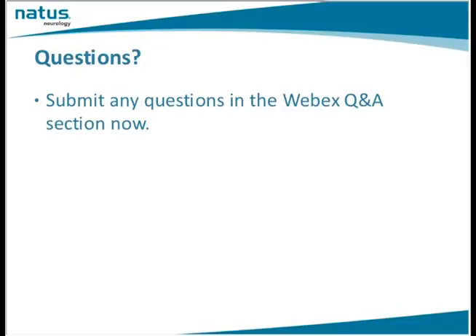Here's an interesting question we get a lot: any advice on using the headgear on a child? Oh boy, that's a tough one. Babies and neonates, we can't. The kid has to be at least toddler age. You make your headgear as small as you can, using that baseball cap device in the back. I either pad it with lamb's wool, or ABD pads, abdominal pads that are very thick dressings.